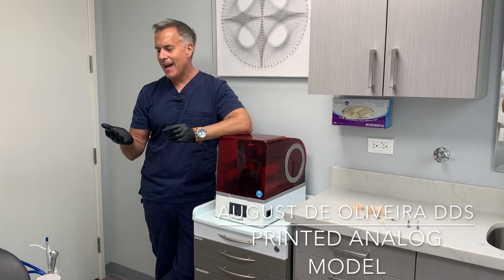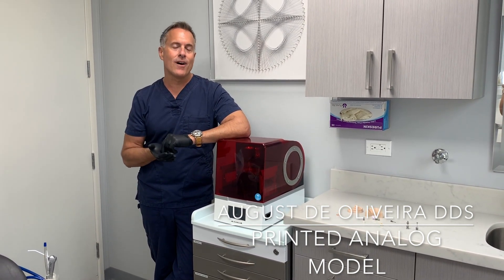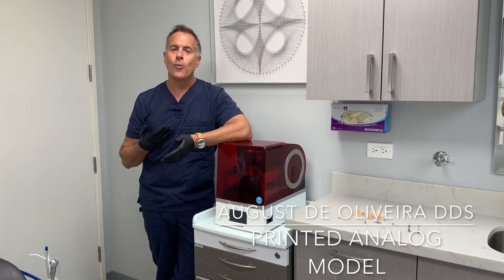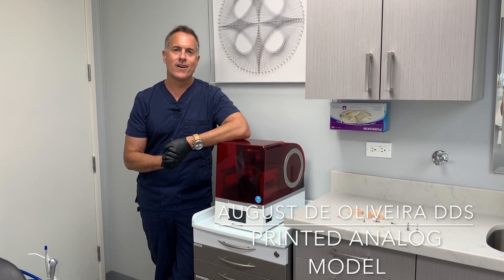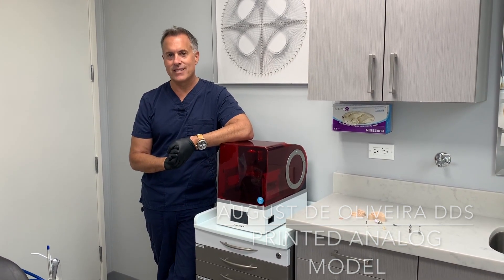You take an impression, the lab screws in a conventional implant analog, and pours up the stone. What happens if you want to reuse that analog? Well, you've got to dig it out, and in doing so, a lot of the times you damage the analog itself.